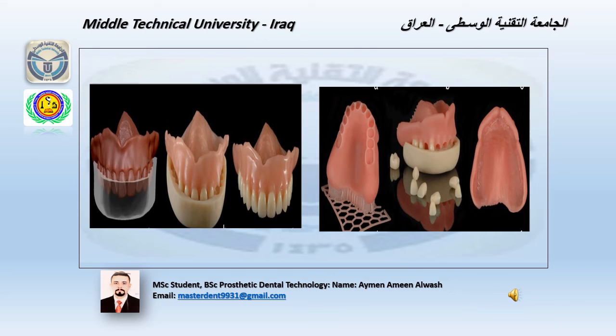To ensure the proper position of artificial teeth in the denture base, a transfer key was designed in the software. راح نصمم الترانسفير كي باستخدام السوفت وير اللي هو راح يشتغل كاندكس حتى يحافظ لي على علاقة الأسنان مع الدنتشر بيز without any changes. راح نسوي set للأسنان inside the transfer key or inside the index وراح نستخدم الكولدكيور acrylic resin حتى نسوي bonded between the denture base and artificial teeth. راح نضيف الكولدكيور acrylic resin على السوكت of the denture base.